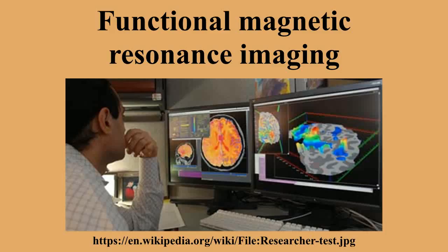This is expected to be due to increased efficiency in performing the task. The BOLD response across brain regions cannot be compared directly even for the same task, since the density of neurons and the blood supply characteristics are not constant across the brain. However, the BOLD response can often be compared across subjects for the same brain region and the same task.